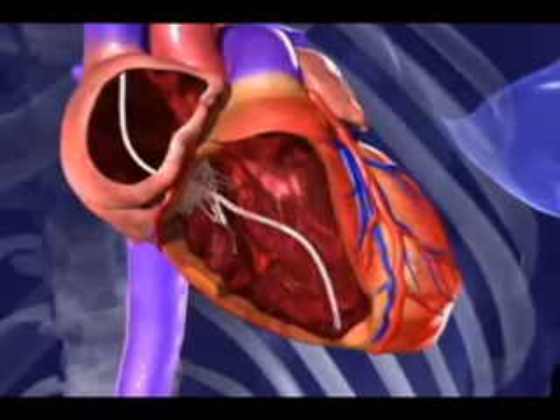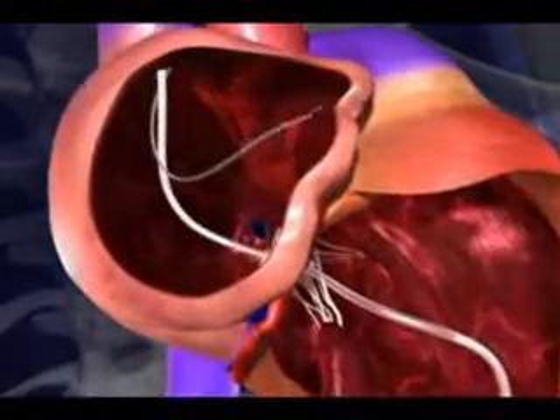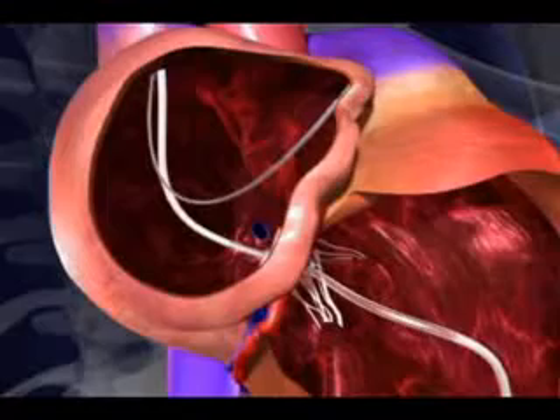The best location is chosen and the wire is secured in that location. After testing is done, a second wire is introduced into the right atrium of the heart, which is the top chamber seen in the animation.